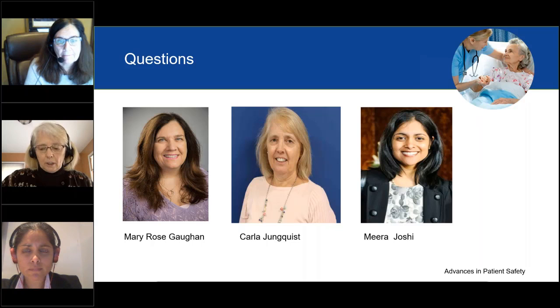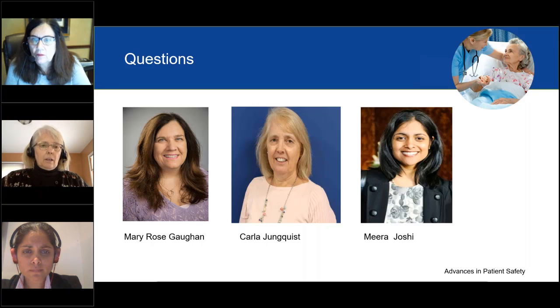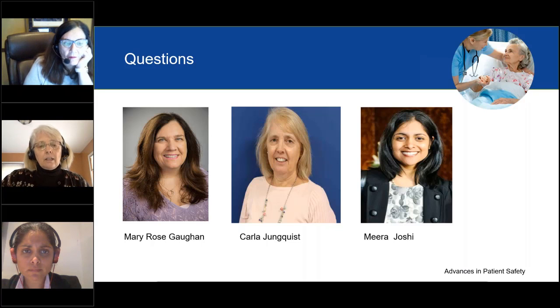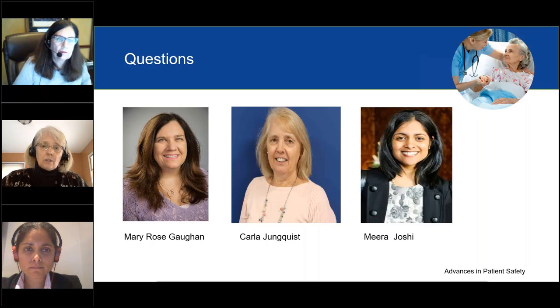Thanks, Mary Rose. That is a really good question. So the American Society for Pain Management Nursing published monitoring guidelines, and I'm sure they would apply over the pond in the UK also. But what it basically says is that you have to measure respiratory rate, a measure of ventilation, so it'd be respiratory rate and oxygenation, or CO2, or a minute ventilation at baseline, at peak effect. And when you have a PCA, it is how you know when peak effect is, because you don't know when the patient has pushed the button. So it's really important to have them on continuous monitoring. And there have been studies that show that continuous monitoring with PCA use really improves patient safety and decreases adverse events. So if you're doing intermittent monitoring, you better be measuring level of consciousness also.